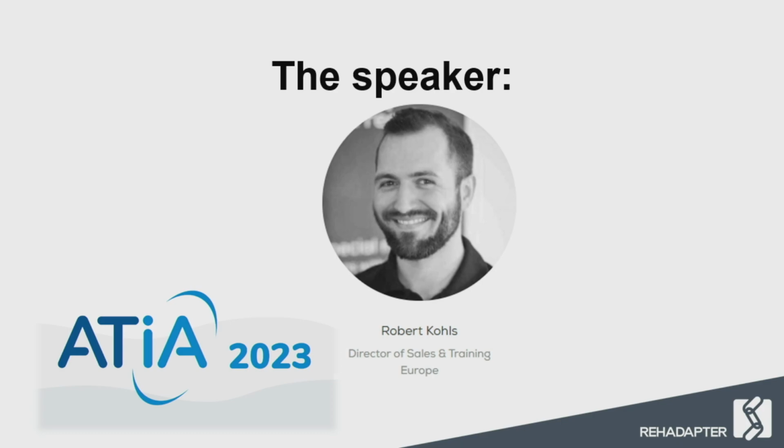I hope you can see something. Give me a second. So usually it should start doing something now. Okay, here we go. Usually I would show you that with sound. Someone suggested to do some beatboxing, which maybe will not work in combination with the product.